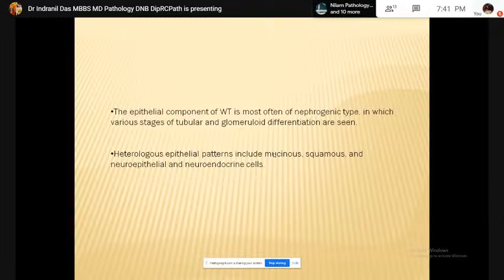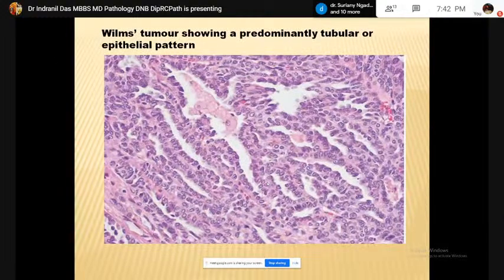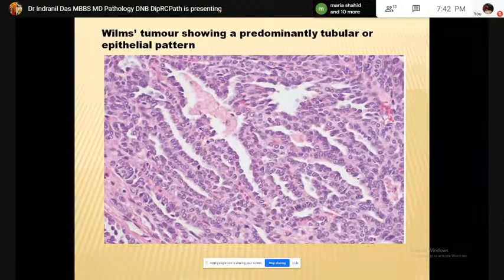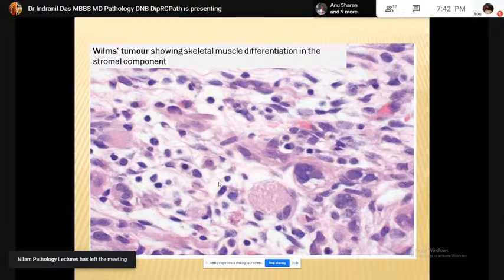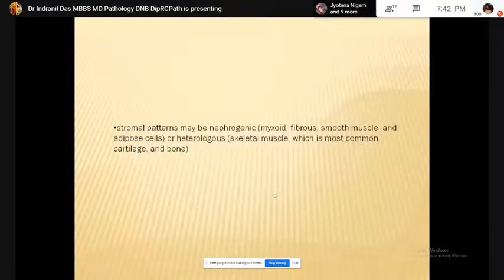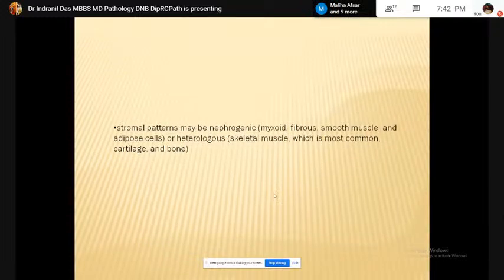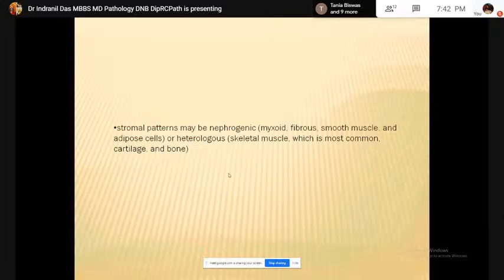The serpentine pattern of growth is characterized by broad bands of undifferentiated cells surrounded by fibromyxoid stroma. The blastema consists of randomly arranged densely packed small cells with dark blue nuclei, frequent mitotic activity, and inconspicuous cytoplasm. Aborted glomerular structures may also present in Wilms tumor as foci of epithelial differentiation. The epithelial component of Wilms tumor is most often of nephrogenic type with various stages of tubular and glomerular differentiation. Heterologous epithelial structures may be present as mucinous, squamous, or neuroepithelial cells.